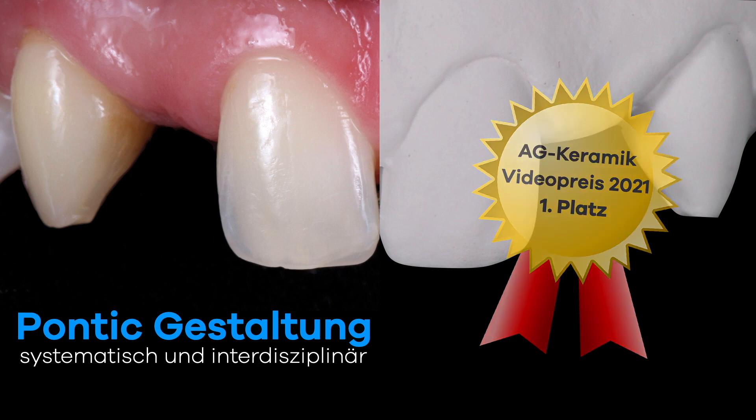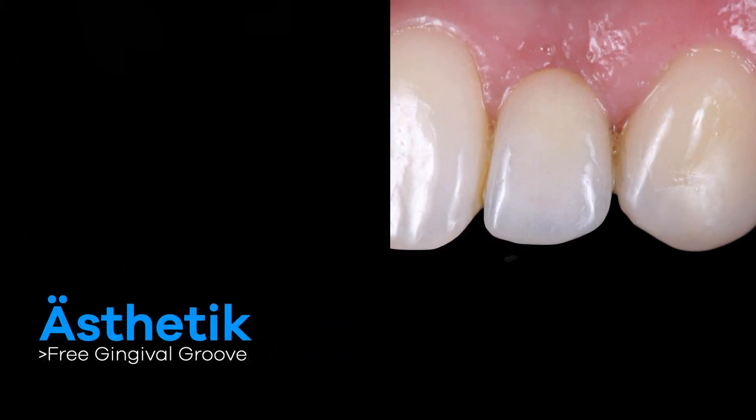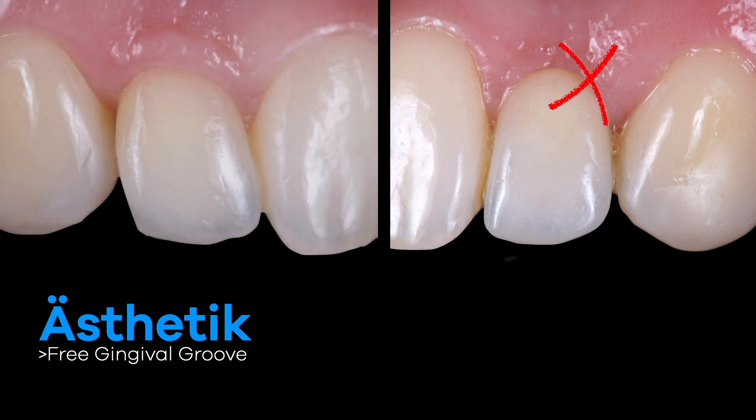Tips and tricks for a systematic and interdisciplinary pontic design. Here you can see a classic oval pontic, which is an unsatisfactory result for us.